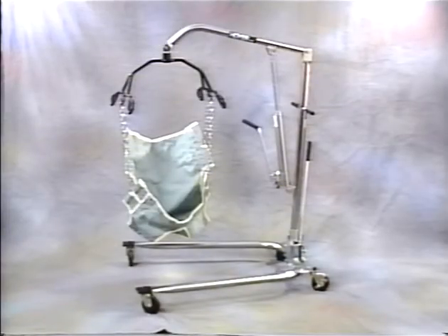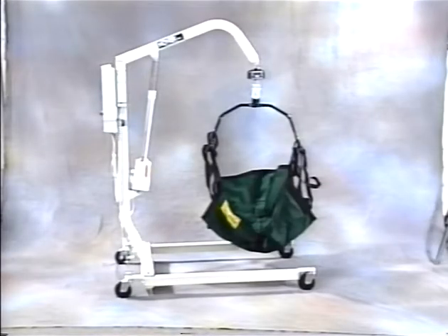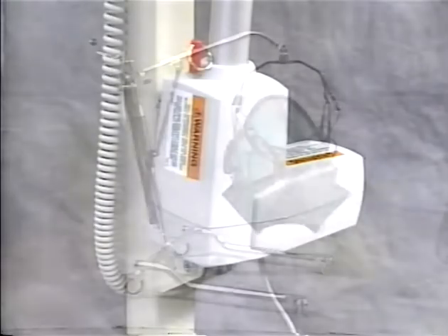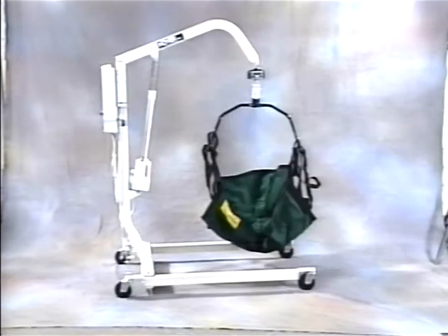Hoyer makes several models including hydraulic, crank-operated, and power-driven lifters. While each of these lifters has features that make it unique, they share some basic similarities. By learning the components and construction of one model, you'll understand the basics of several different lifters.